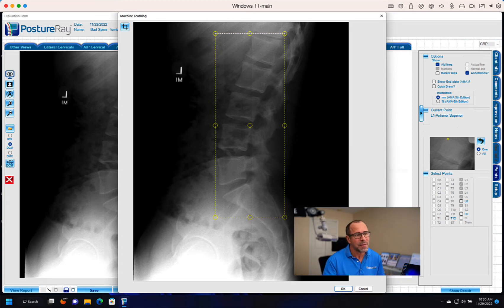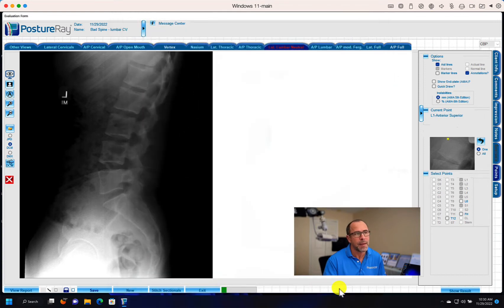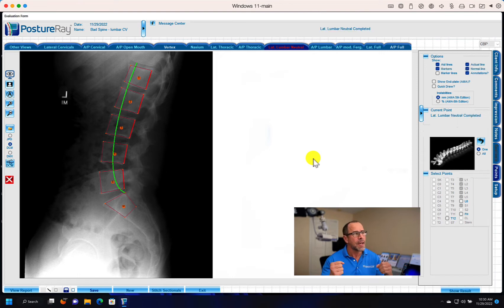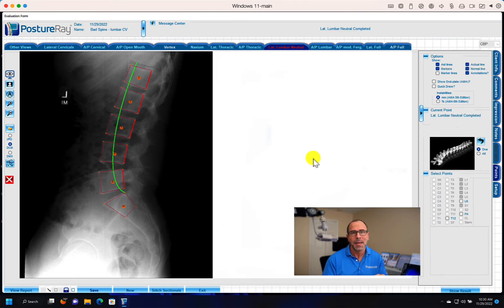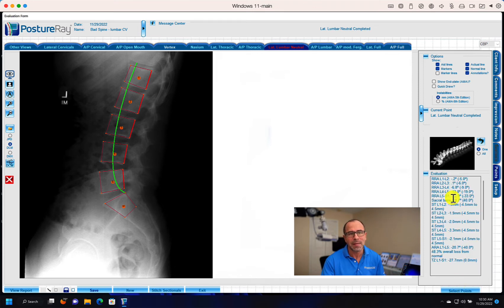So check this out. If I go ahead and box in just L1 through L5 and S1, the computer will analyze the x-ray in real time and give you back the digitized assessment, noting all rotations and translations.